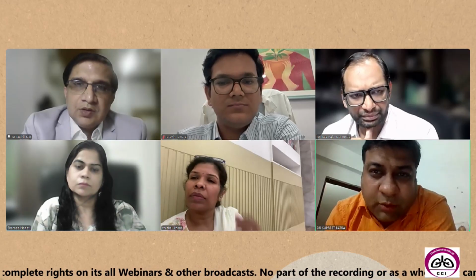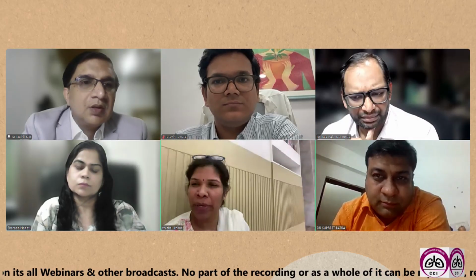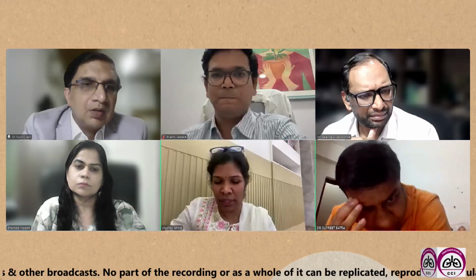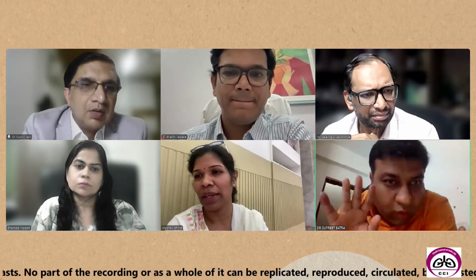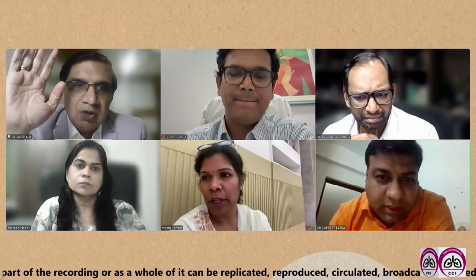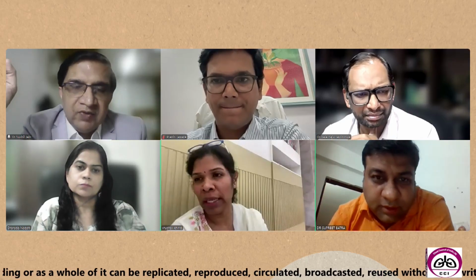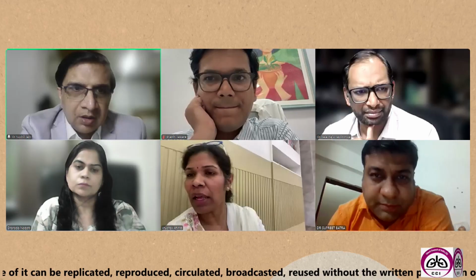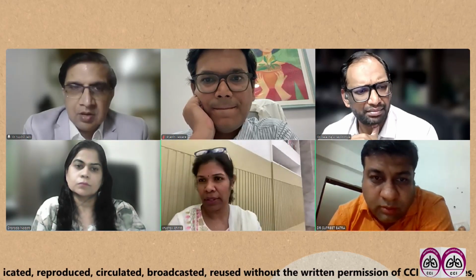Yes. This was my next question: if you're suspecting sarcoidosis and doing TBNA, how many of us change over and do an endobronchial biopsy? We do all 3: endobronchial, transbronchial, and lymph node. Even if the mucosa is normal, I would still like to do it. Even with an EBUS, you're again doing the others.